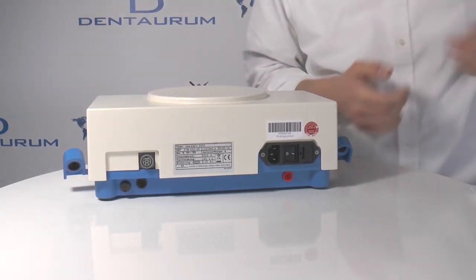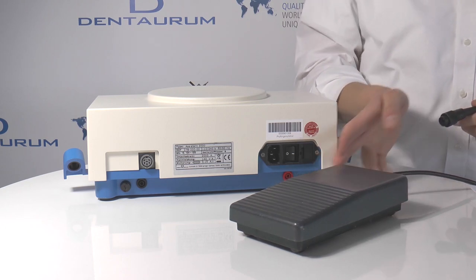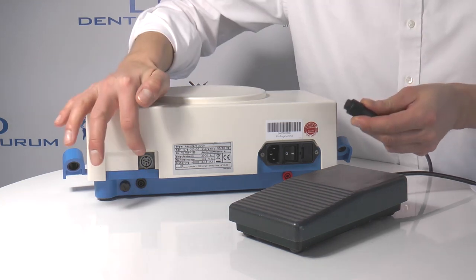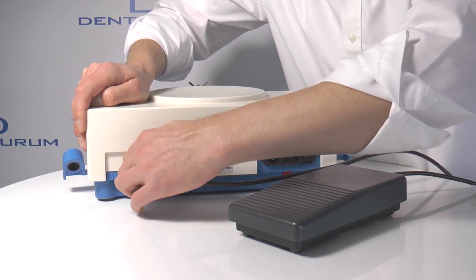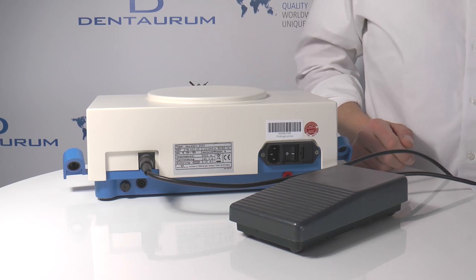This is the footswitch you can use for soldering and welding. You can plug it in here and just use it or not. You don't need to flick a switch to choose between the manual button on the unit or the footswitch.